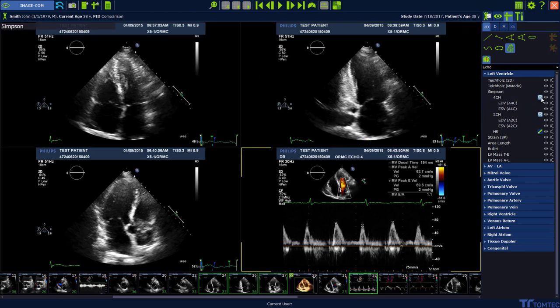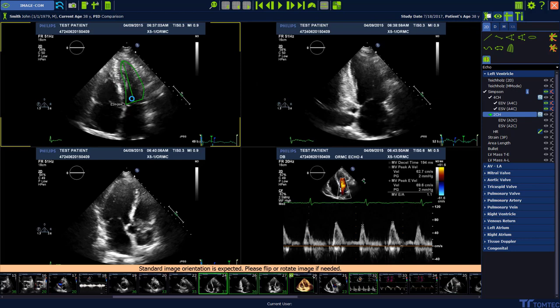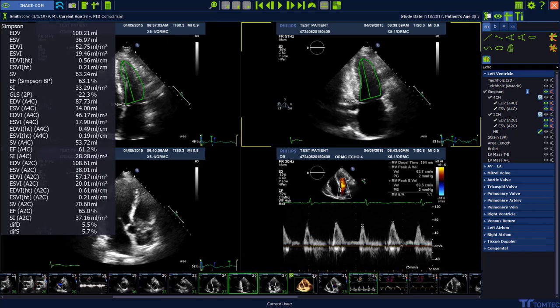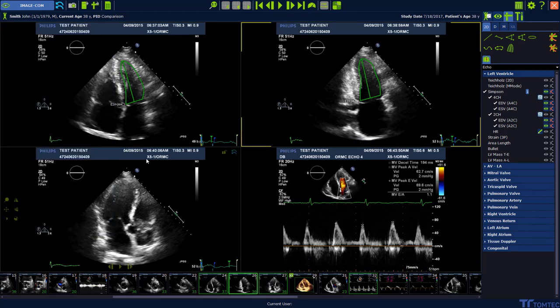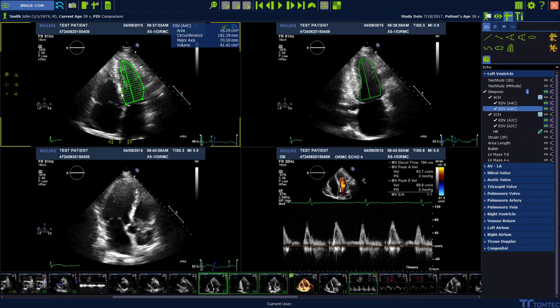Now click the automatic detection button and tell the software where to find a 4-chamber view and a 2-chamber view. The contour is now automatically tracked in end-diastole and end-systole. You can adjust the contours — add points with the left mouse click and delete points with the right mouse click.